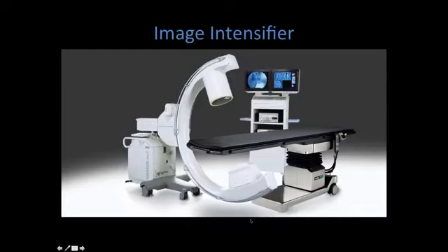Again, this is a classic C-arm. The X-ray generator is located at the bottom. You should be able to identify the two different components of the C-arm. And now we're going to focus on the actual image intensifier tube.